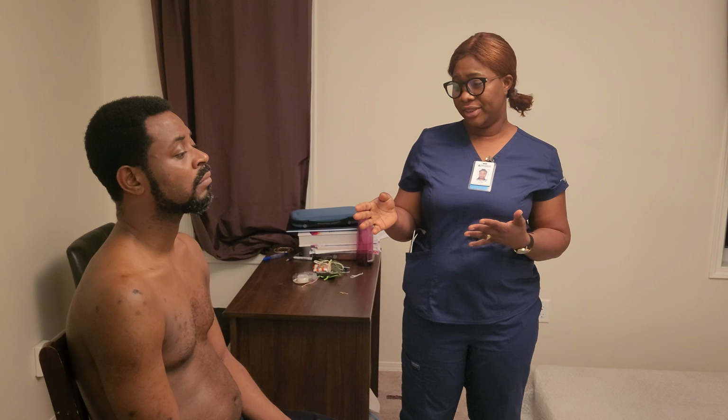I'll auscultate the lung fields. I'll be starting from the apices in the supraclavicular areas down to the sixth rib. So I would start from there, and I'm going to go to the second intercostal space, which is where the angle of Louis is. Then I'll be comparing the breath sounds from one side to the other.